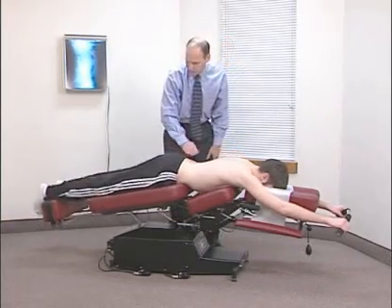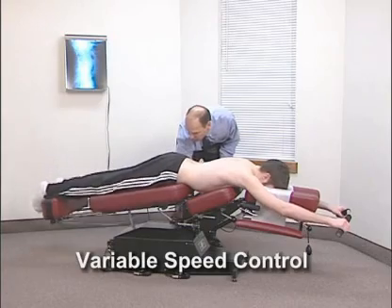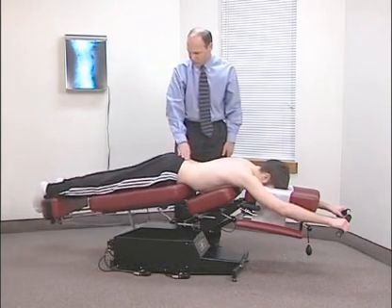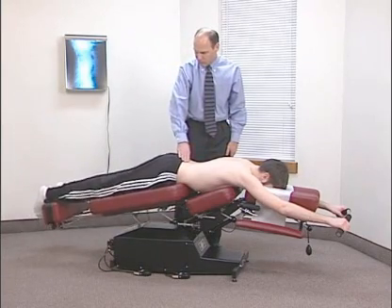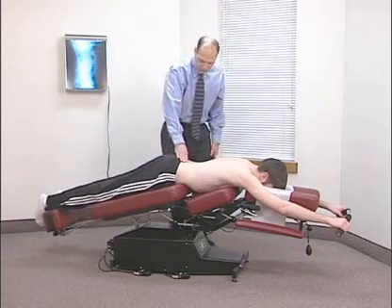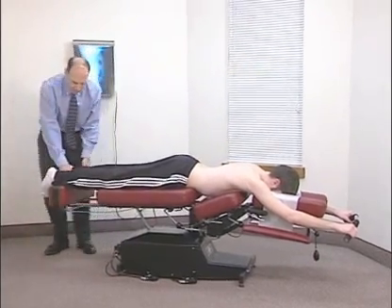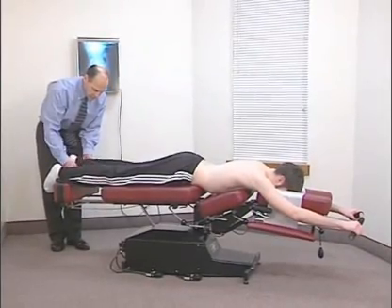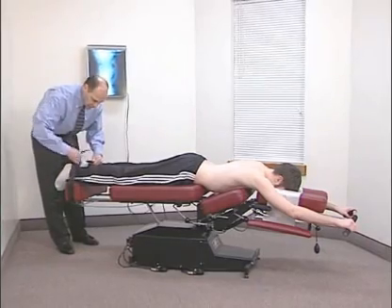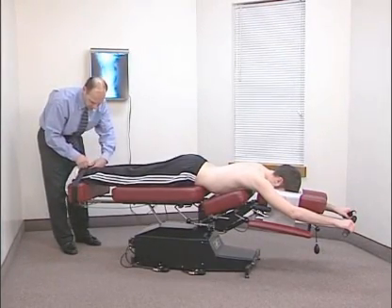Some motorized flexion distraction tables are equipped with a variable speed control. A variable speed control allows the doctor to reduce the speed of the caudal section, making it easy for the patient to adapt to motion. After the patient is comfortable with full flexion distraction movement, ankle straps can be applied to increase long axis distraction. They are also helpful in stretching tight hamstring muscles, calf muscles, and gluteus muscles. Do not use the ankle straps with patients who have severe hip, knee, or ankle pain.